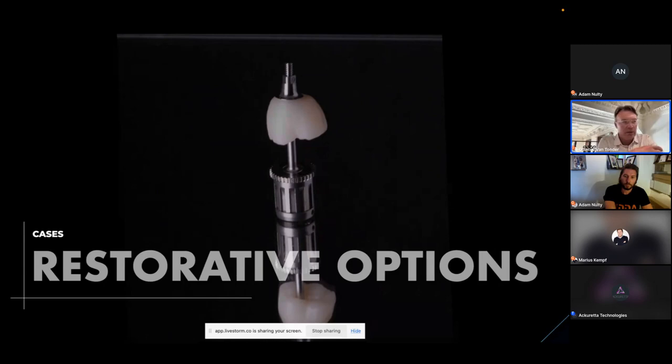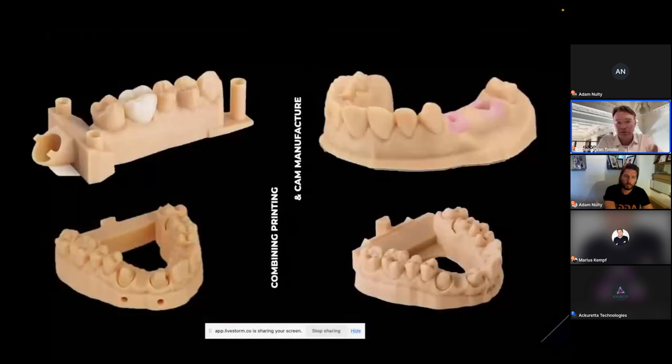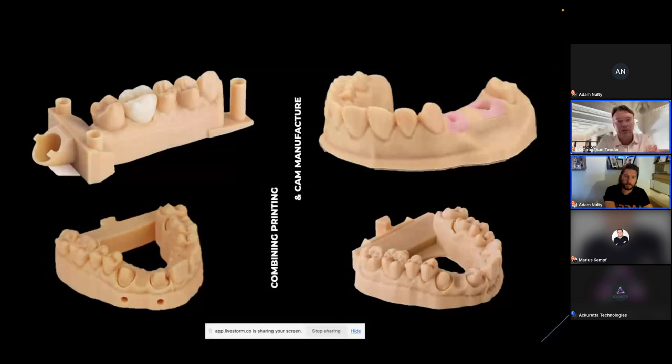So especially if you want to look at, for example, provisional bridges, provisional mock-ups for smile designs, getting patient consent and making sure that everything is functioning properly in difficult occlusions and those kinds of things, that is where 3D printing is an awesome solution. Because if you've designed, say, 5 or 6 units together in a bridge or separately, you can print them out in 25 to 30 minutes, have that finished with your post-processing in another 25, 30 minutes. You can put that in for the patient as either a long-term temporary or as part of their consent and get them to sign off on that.